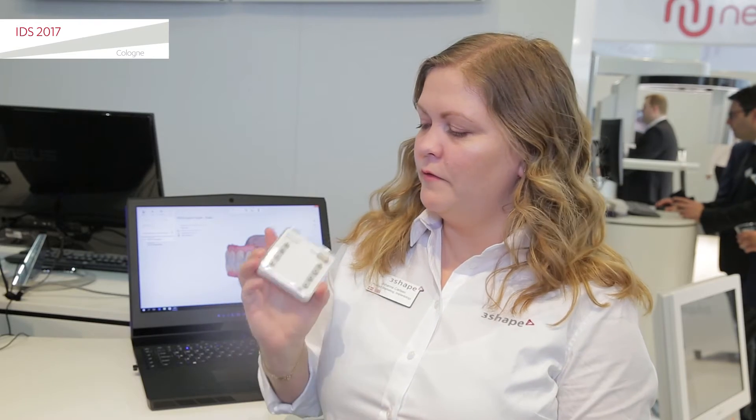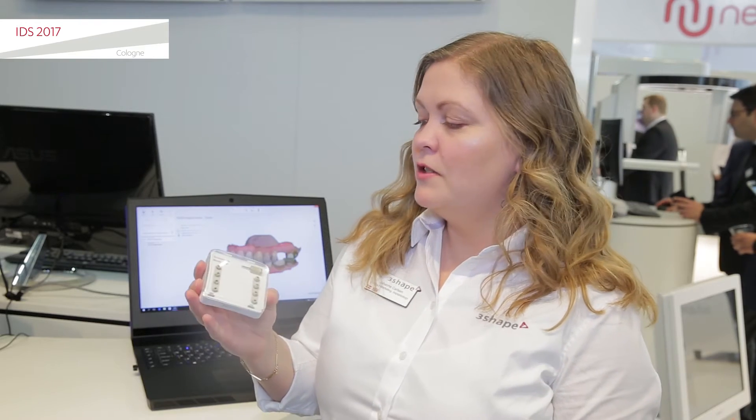Hi, my name is Johanna Carlsen. I'm the Product Marketing Manager for Implantology. One of the cool new things that we're launching here at IDS are the 3Shape scan bodies. So, why is 3Shape making scan bodies?